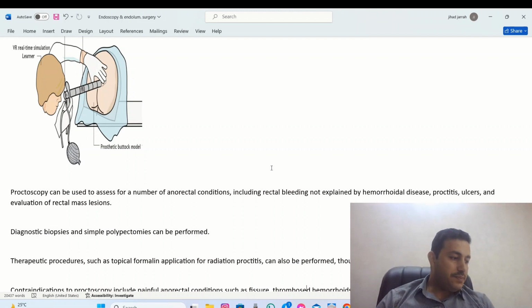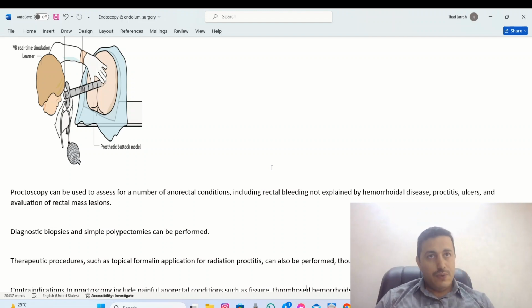Okay. Also, when you go back, we will talk about the withdrawal time. Go slowly as you go back and inspect. You may need to sweep the proctoscope right and left, up and down, to flatten the folds of the rectum.